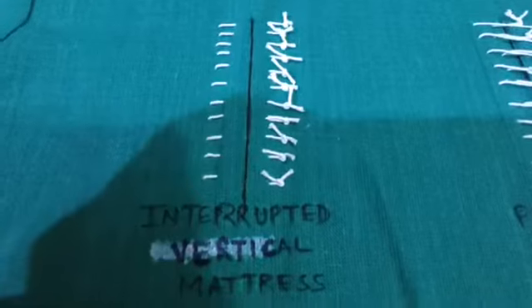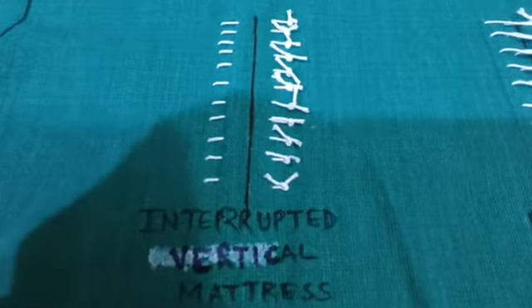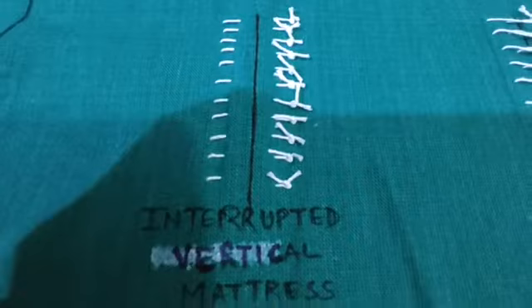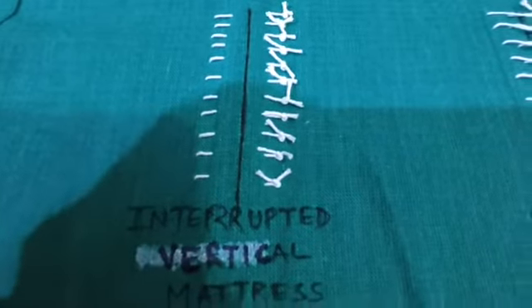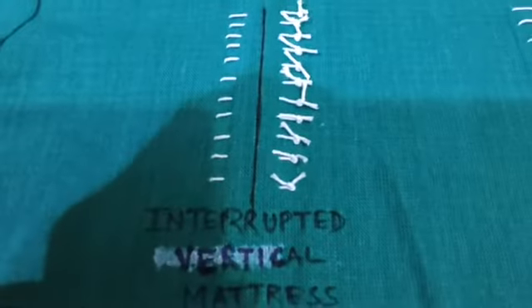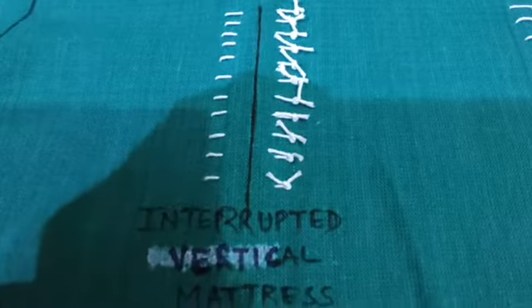The next is the interrupted vertical mattress. It is also an apposition suture pattern, and it is also used for the apposition of the wounds of skin, muscle, and esophagus.